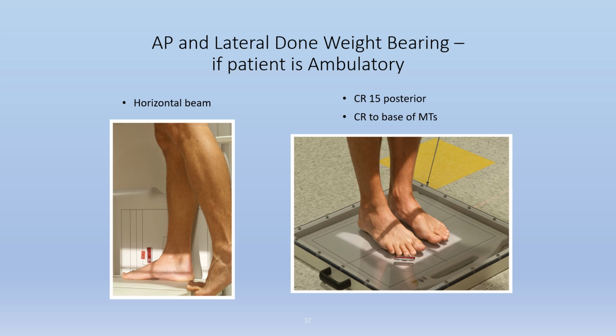And what the weight-bearing does is demonstrates the bones when they're under pressure, under the full weight of the patient. All right, so it shows the longitudinal arches, it shows how the bones behave under the patient's full body weight.